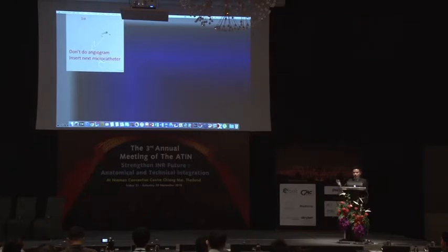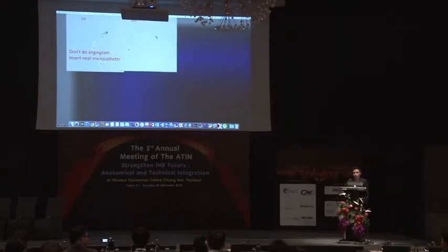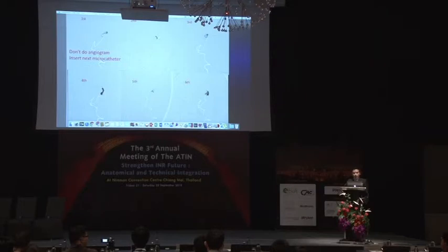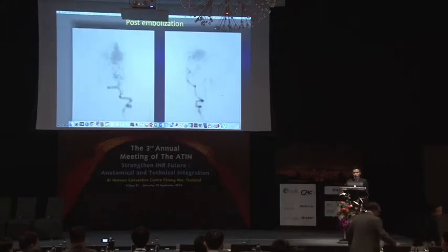And then after that, if you need to embolize further, in my practice, I think you do not need to run the angiogram again. You can use the same roadmap, the previous roadmap, and then put the next microcatheter for the second catheter, third catheter, and then into the sixth catheter. And you can embolize for the sixth glue injection in this station. And then you have the contrast to run the angiogram.